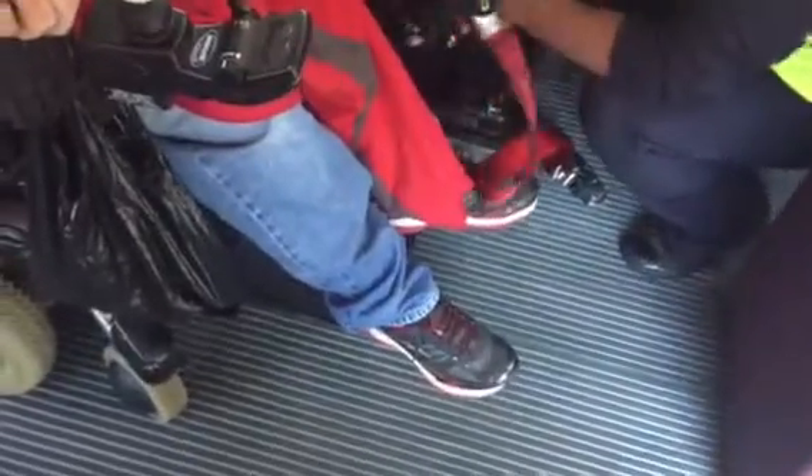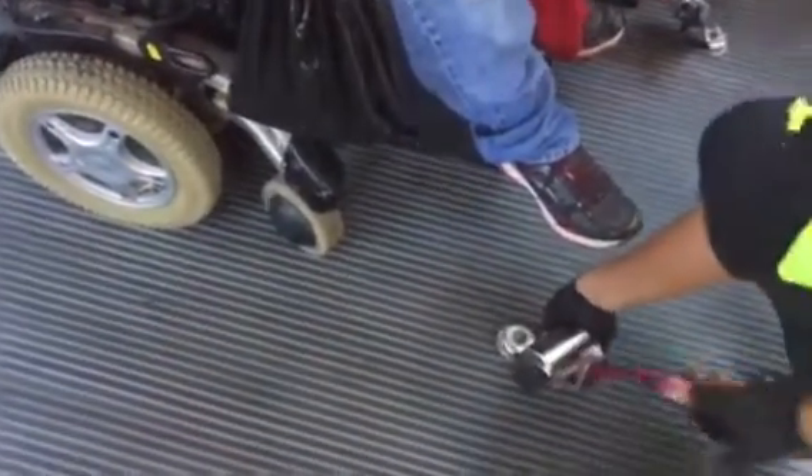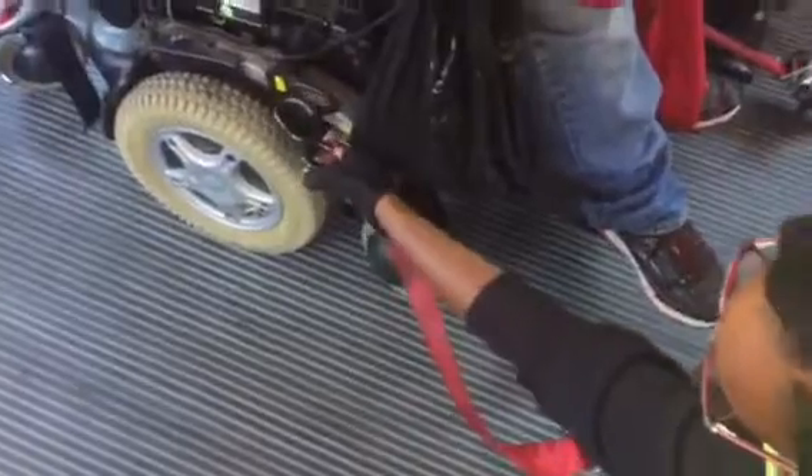Now coming around the front to do the front tie downs. Right front coming over there, hooking it to the bottom of the chair and tightening it down. Now she's taking her last strap, tying it on the front right, coming around and hooking it to the wheelchair.